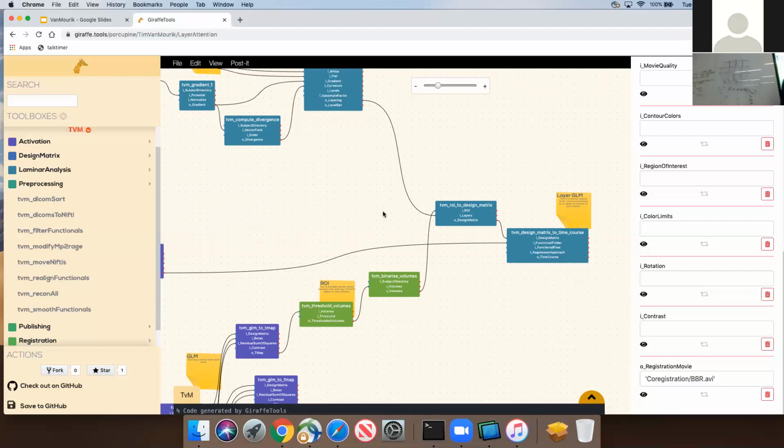Yeah, that's a great point. So that's indeed our rule of thumb, approximately: if you have a cortical thickness of 3 millimeters and a resolution of 1 millimeter, 3 divided by 1 is 3 layers. That's sort of the ballpark that we're using.